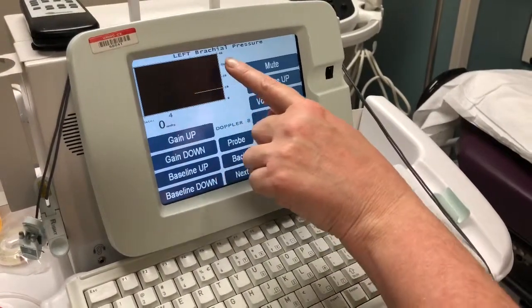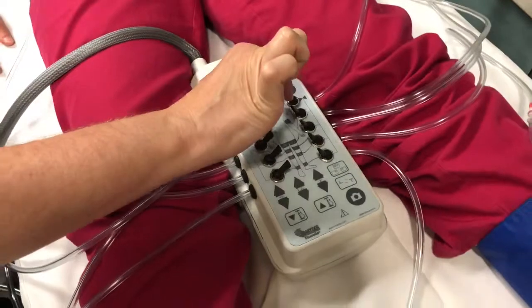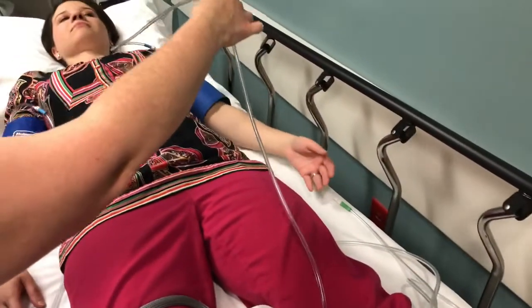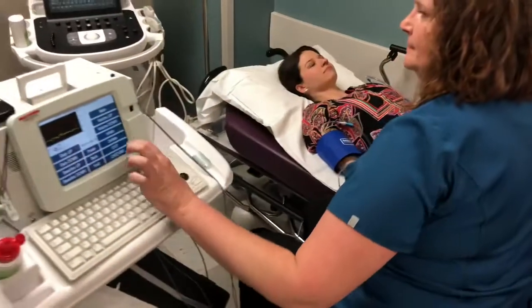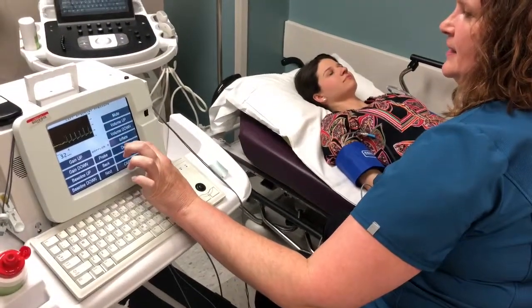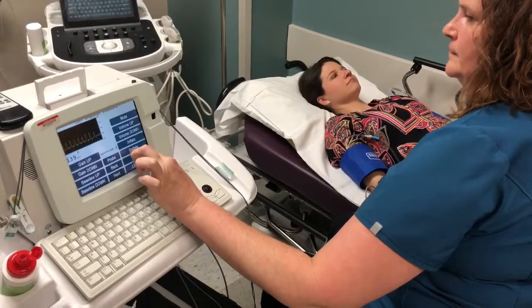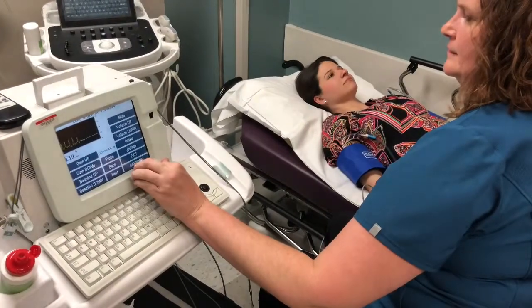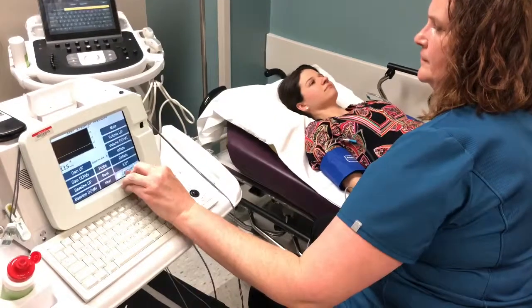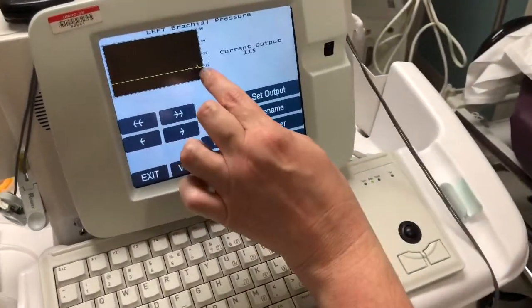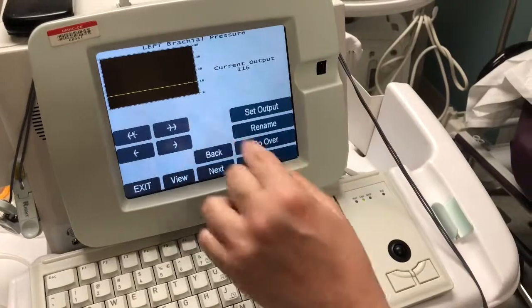Now it has you set up for the left brachial pressure. Over here on the main hub I will take it off of the right brachial and select the left brachial — you can see this tube is hooked up to her left arm. I will acquire the pulse and hit inflate. If you had waited for a number of pulses to occur, you can always travel back to the most appropriate pressure and then hit next.